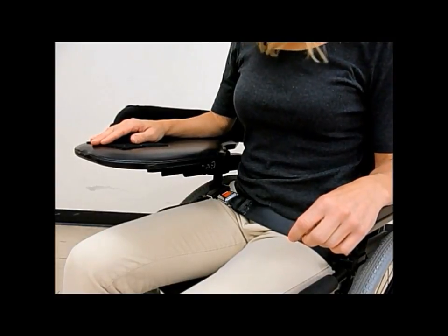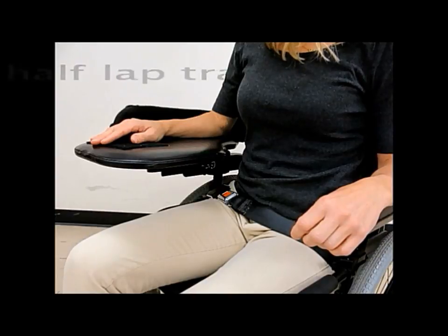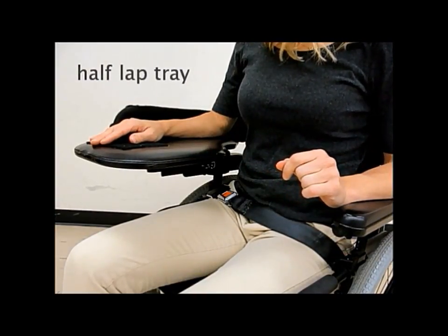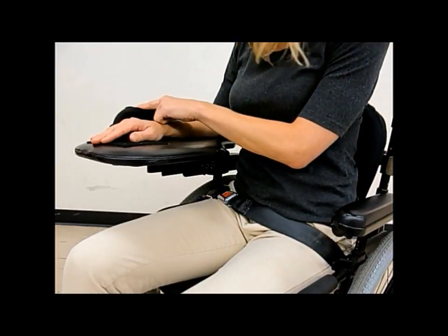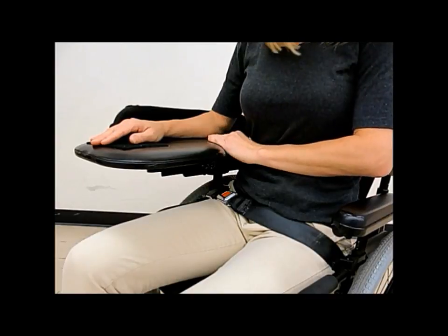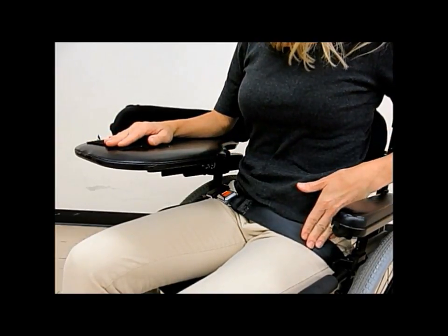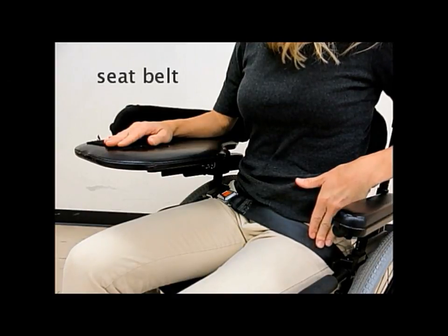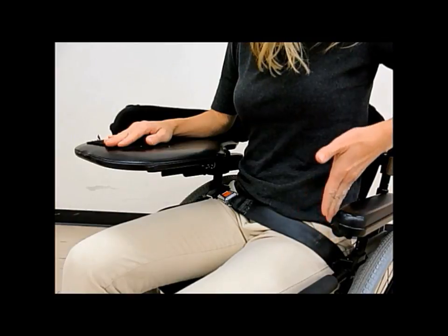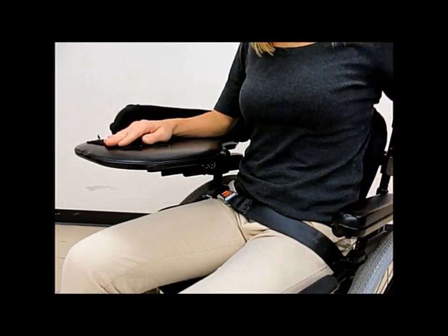For the hemiplegic arm, you'll need to support the hemi hand, arm, and shoulder with a half lap tray or even a full lap tray. You may need an elbow block like this one, or a medial block, which would be on the inside here, to optimize positioning. And a seat belt can help maintain pelvis from sliding into posterior pelvic tilt, but it needs to be angled vertically and snug, not as a restraint, but as a positioning device.